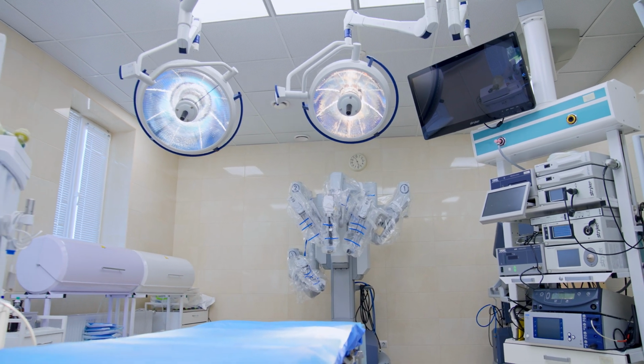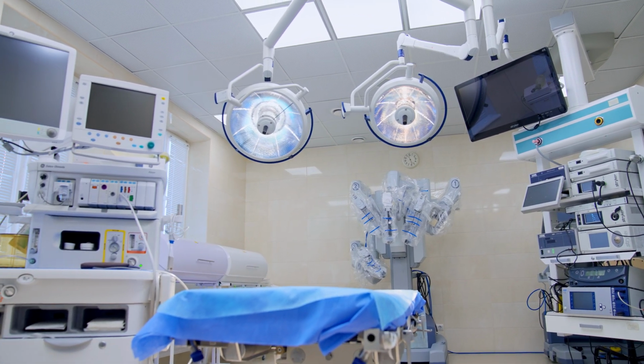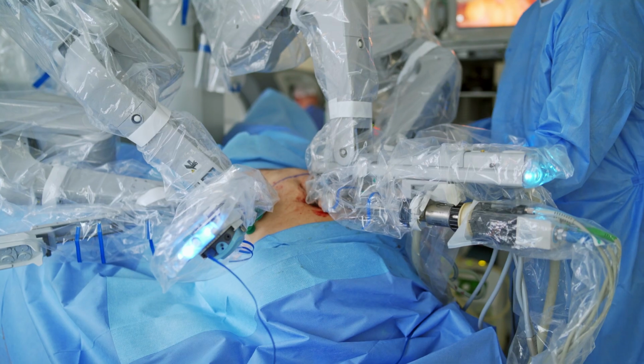You can use small incisions, right? So now the problems that you would have with a large open incision go away. So you don't have wound infections. You don't have mesh infections occurring anymore because that large incision is gone. The amount of healing that is required is much less traumatic. The whole inflammatory response that you have to trauma is much less than what it would be with traditional surgery. So the healing time is quicker and pain is less. People return to work quicker. All those advantages.